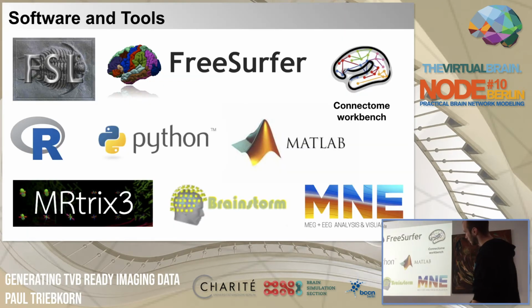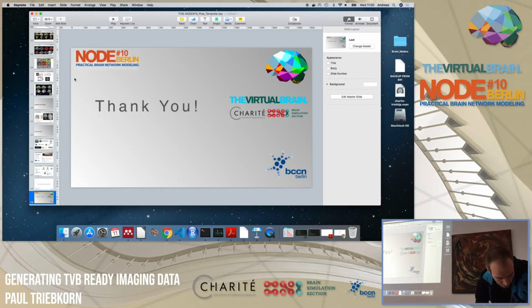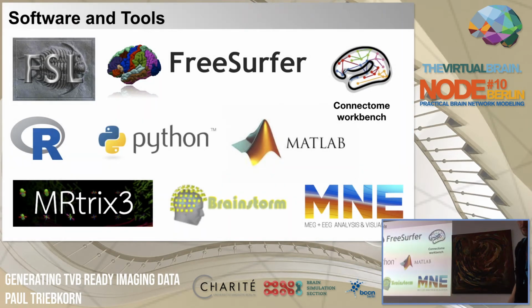So just briefly in the end, I just want to give an overview of what different software tools and packages we are using. I think FreeSurfer and FSL should be familiar to people who are working with neuroimaging data. FreeSurfer does this brain surface reconstruction mainly. It's called the recon-all pipeline. It takes a lot of time, 12 to 24 hours, depending on your computer resources. FSL, you can run in parallel a little bit and it gets faster on a cluster. FSL has many different tools and options to process data for fMRI, but also, as we said, the surface matching and ICA-FIX, ICA decomposition.